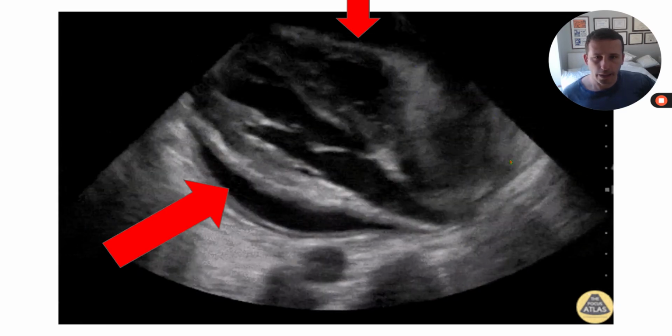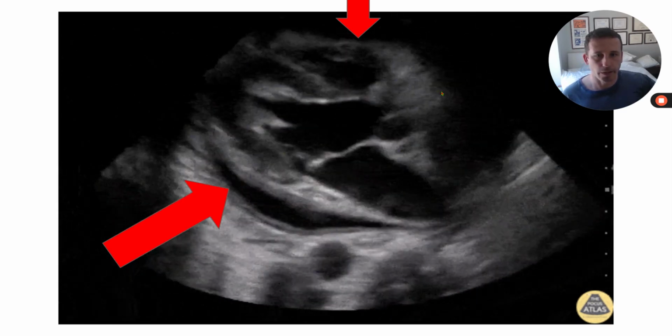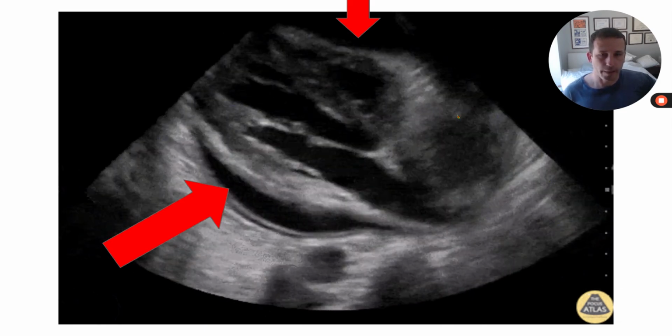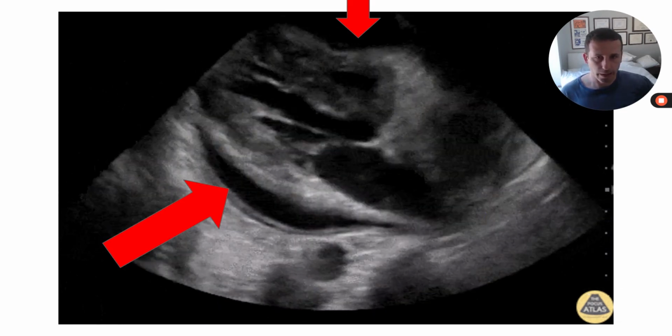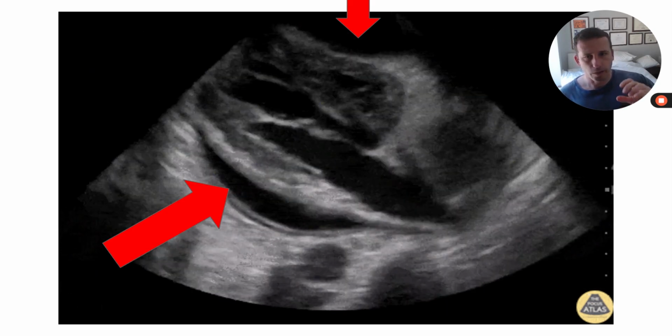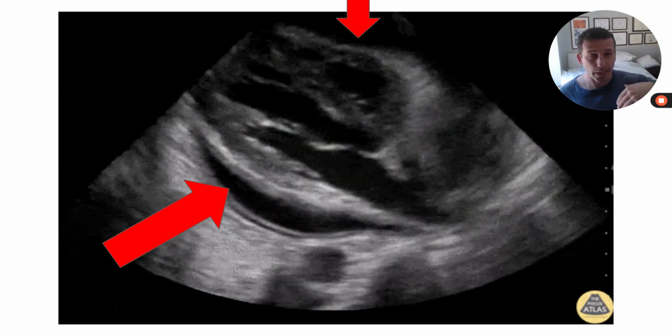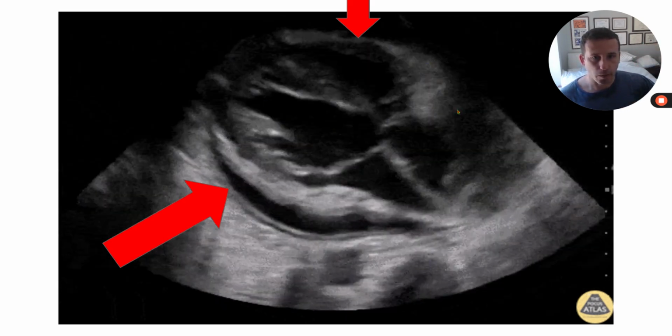And you can see a little bit of actual RV diastolic free wall collapse. So that would be indicative of tamponade physiology, right? The diastole is that lowest pressure part of the cardiac cycle. So if you have enough pressure built up outside of the heart that the RV free wall is collapsing and not filling fully, then you can wind up with tamponade.